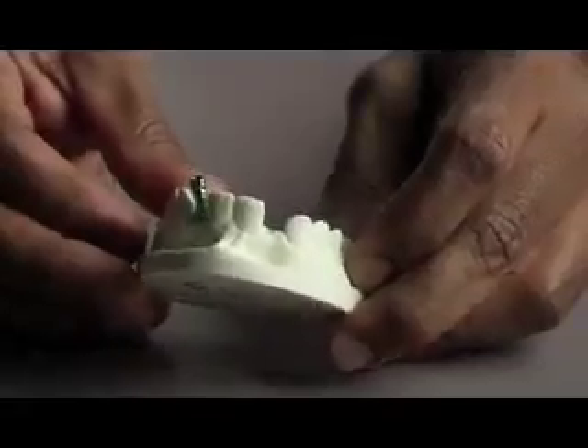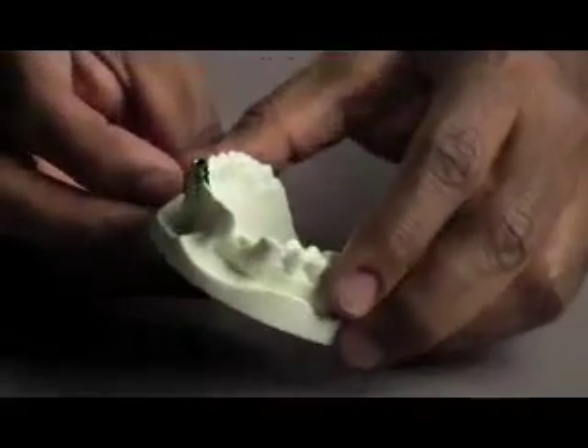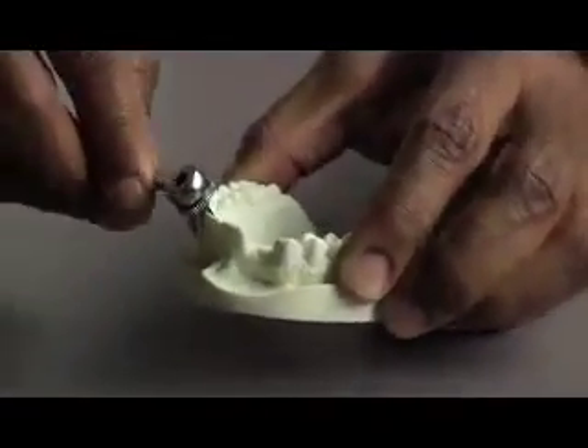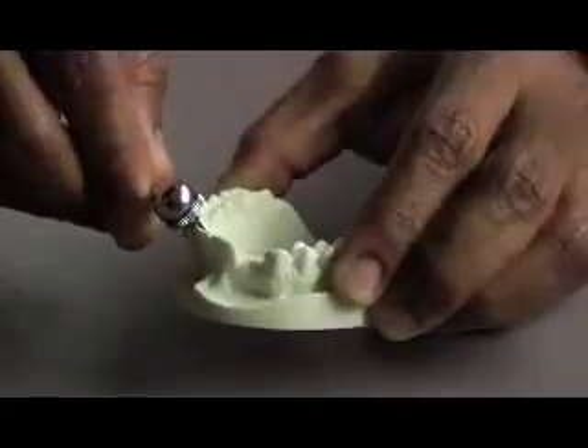We start with the tooth and go to where the implant needs to be placed, instead of the traditional way of putting the implant where the bone is and making it work. This shows an implant that's already placed using that guide, put in to the proper depth and also the proper tightness.